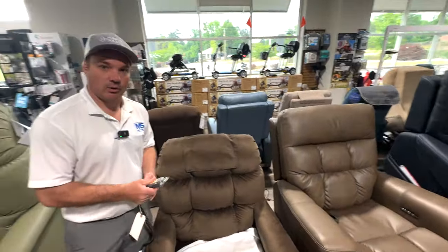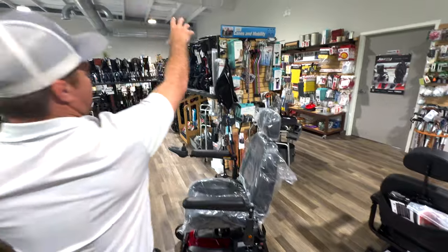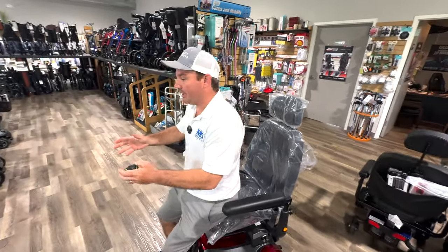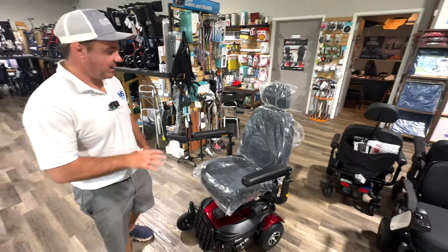These chairs can go into a vertical position. That's a reason you'd buy it — it helps you reach things in your cabinets or when you're cooking. If you're cooking, you can be elevated, essentially standing up, and then when you need to sit back down, the chair is right there for you.